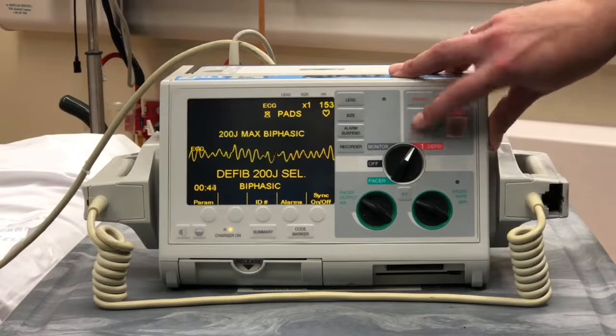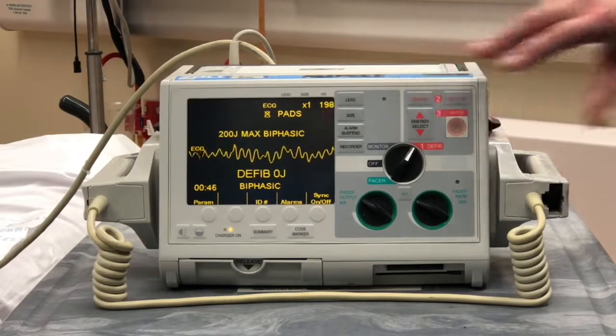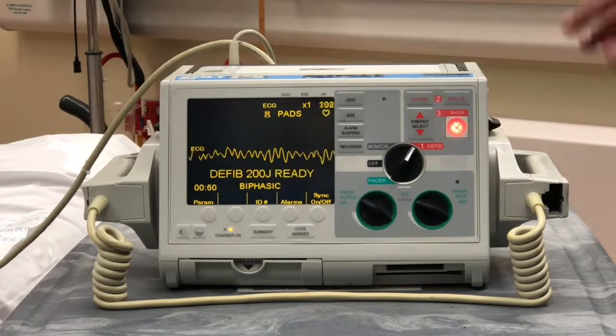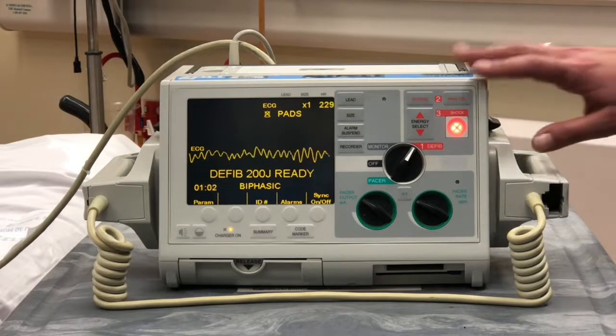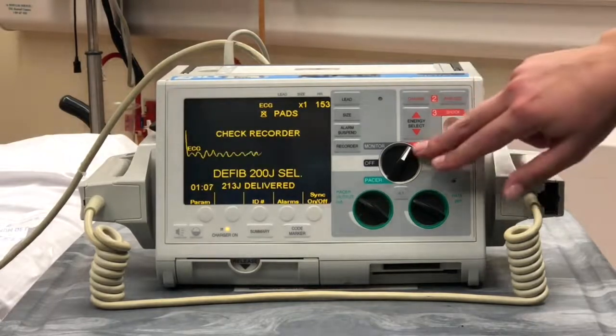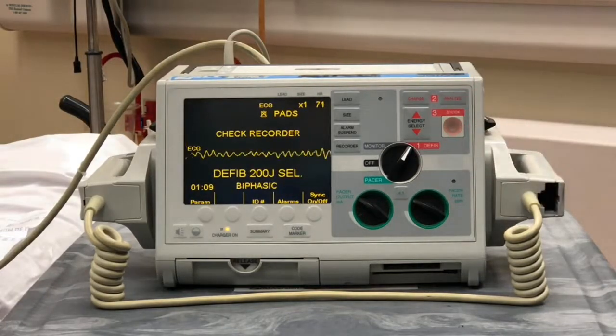defibrillation shock. We've gone up on our energy select to 200 and press the charge button. The button lights up and the tone changes when the defibrillator is ready to shock. You're going to say, shocking on 3, clear the patient, 1, 2, 3, I'm shocking. Press the shock button, and we're going to resume compressions.